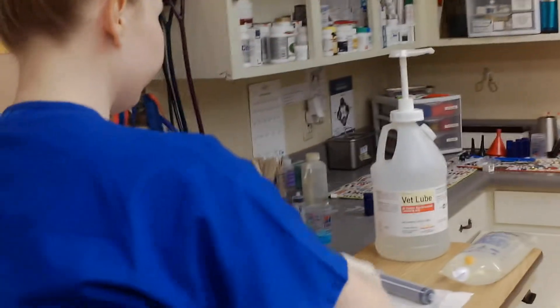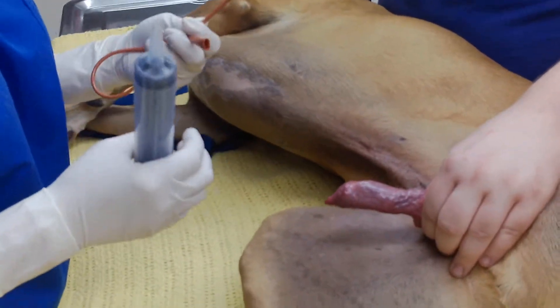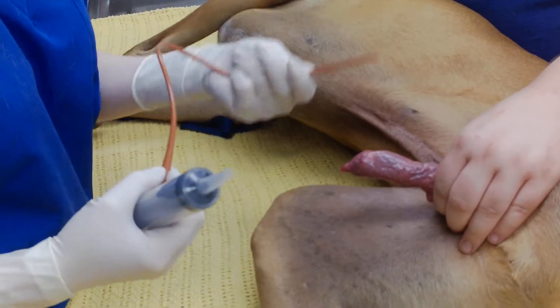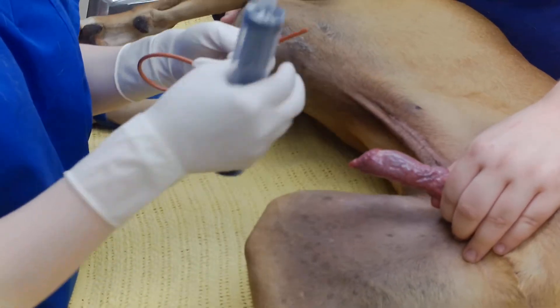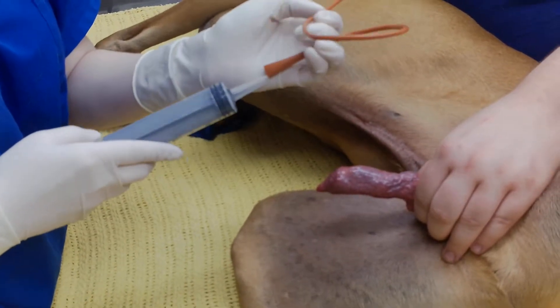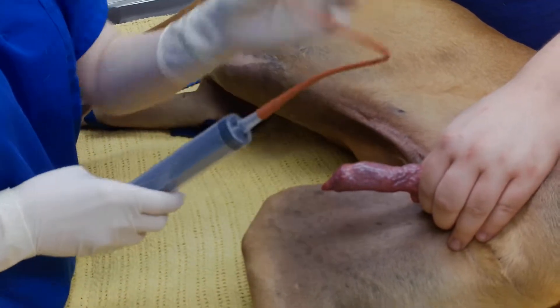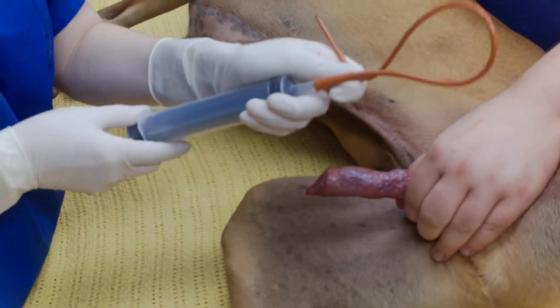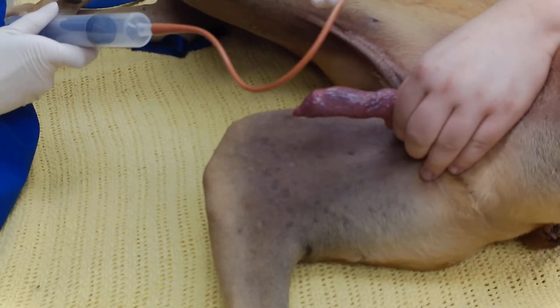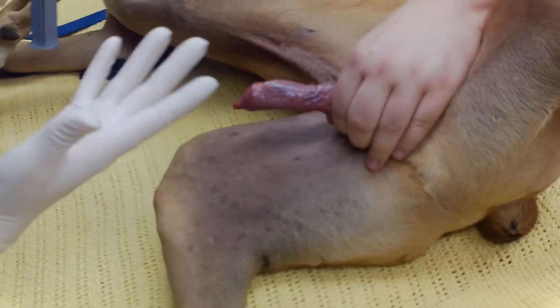If this were to get a urinary sample — we don't typically do cystocentesis on male dogs, though you can. Same idea: lubricate the tip of your catheter, advance it into the urethra, and it's going to come around the ischium into the bladder, and you're going to start seeing urine come out. At that point, attach the 60 ml catheter-tip syringe to the end of the urinary catheter. It's going to be in the bladder, and you start pulling your sample. As you're drawing out, continue to pull on the plunger so that you've completely pulled all the urine out of the track. That is how you would do a urinary catheter on a male dog.